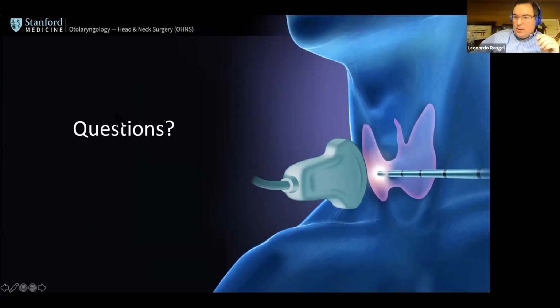Yeah, that's a good question. Many people ask that question. Even the last ATA guidelines address that issue on the Bethesda category on large nodules, and although some papers would consider a higher incidence of malignancy on those larger nodules, many papers disagree with that. So I think if we have a very homogeneous nodule that is a Bethesda 2, if ultrasound characteristics are very benign, it shouldn't be a problem to treat that nodule.